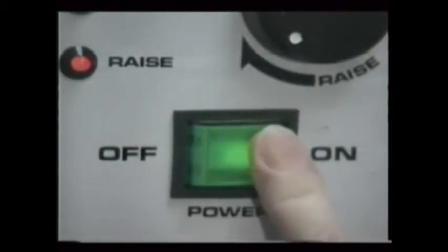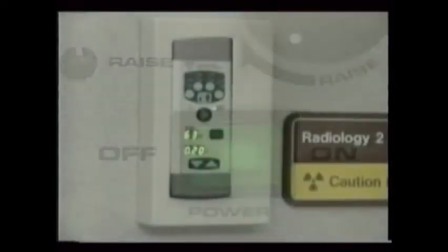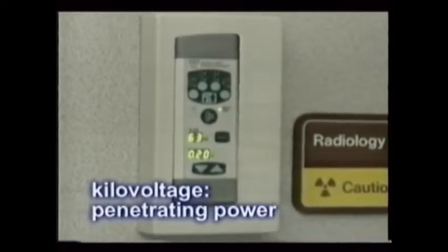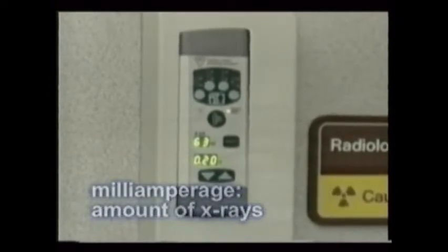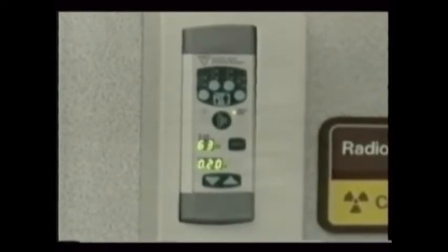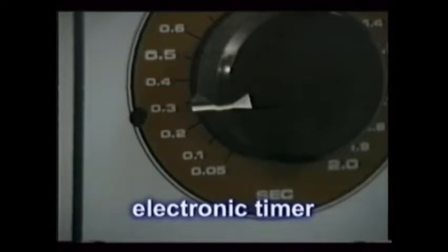The control panels in most X-ray machines are very similar. You'll see some minor variations, from some being fully automatic to those that allow adjusting the kilovoltage, which manipulates the penetrating power of the X-rays, and adjustment of the milliamperage, which regulates the total number of the X-rays. Naturally, increasing either one, the penetrating power or the number of X-rays, darkens the image. All X-ray machines are required to have an electronic timer that allows fraction of a second exposure times.